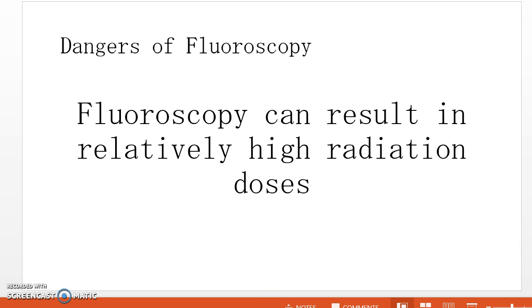Proper gowning and lead shielding will help with the high radiation doses. I mean, some of the radiation cannot be avoided simply because you are in the room, but a lot can be prevented with good shielding. Making sure to wear a full lead shield from the neck to the ankles.